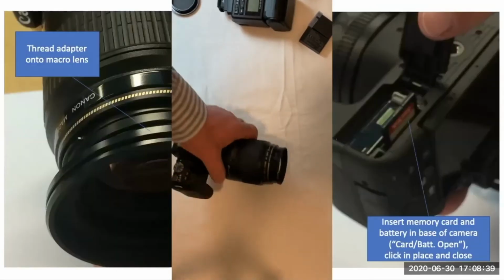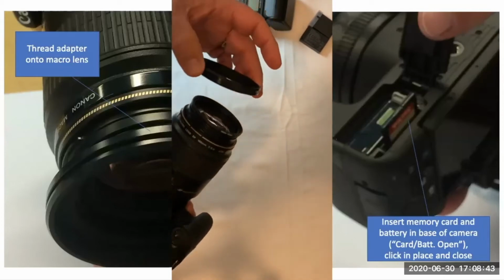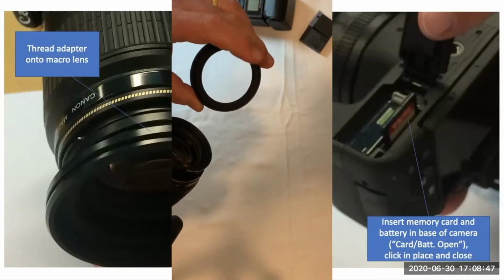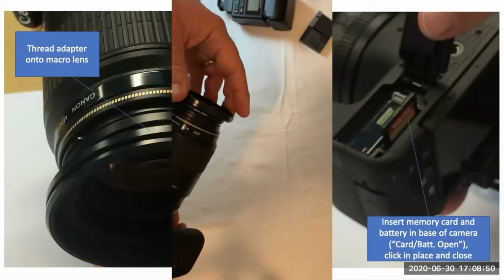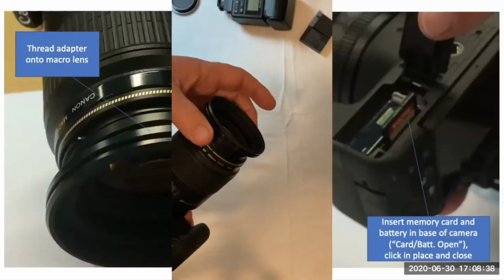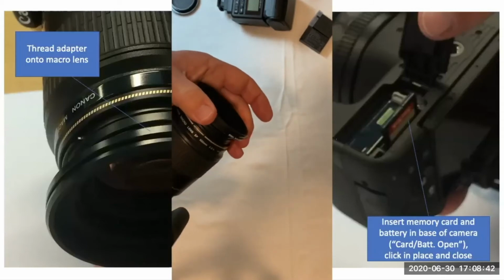So the next thing to do is put on this ring flash adapter. There's a bunch of these, about 3 or 4 different sizes of them. So find the one that fits your lens, twist it on, which should go on very nicely.